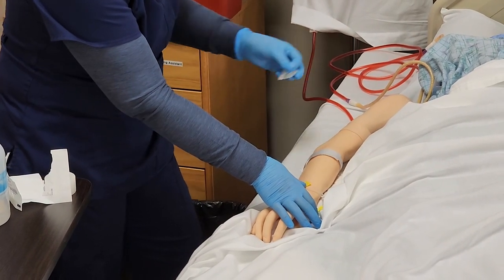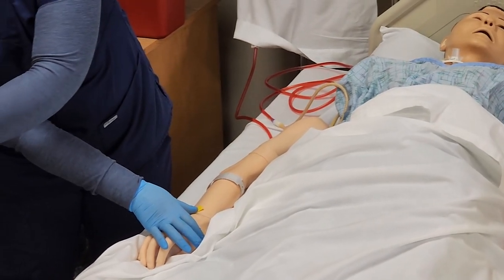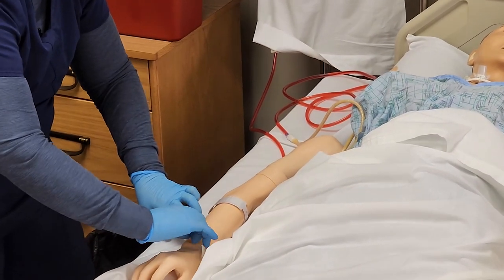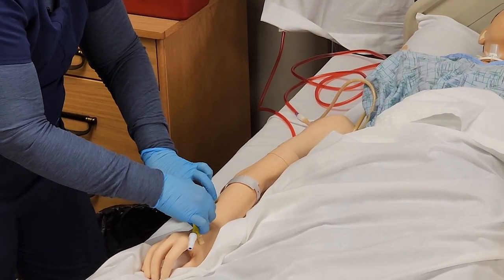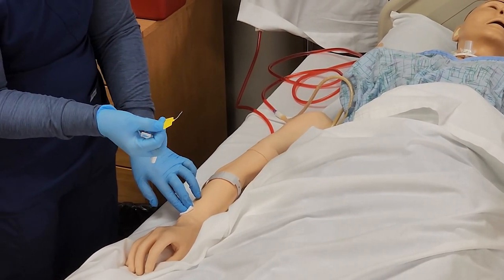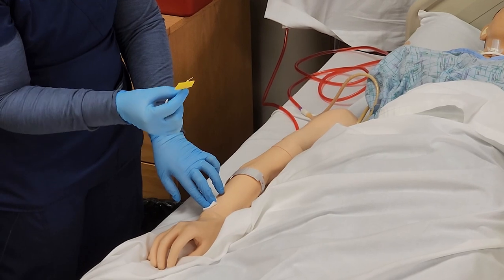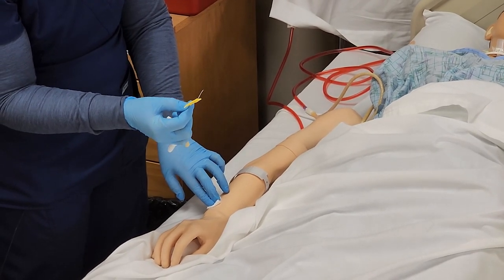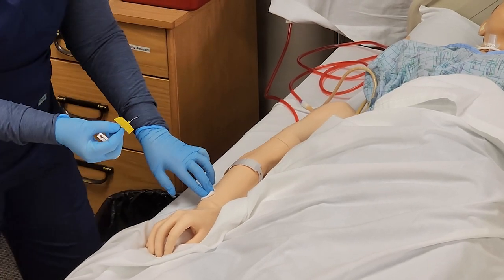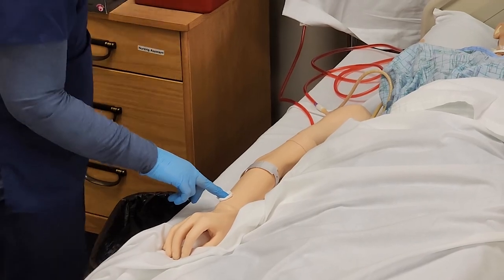I remove the dressing — everything looks good. I grab my gauze and place it over the insertion site, and then I tell the patient I'm removing it. Once I remove it, I'm looking at the integrity of the catheter, making sure that it is all there and intact, and also making sure it doesn't have any drainage that may be suspicious of infection. If there is any drainage, make sure that you culture that.